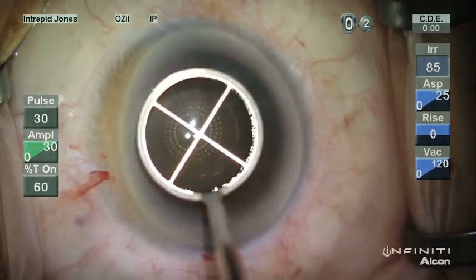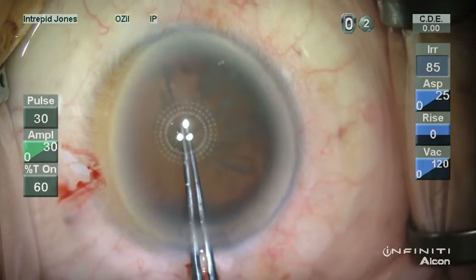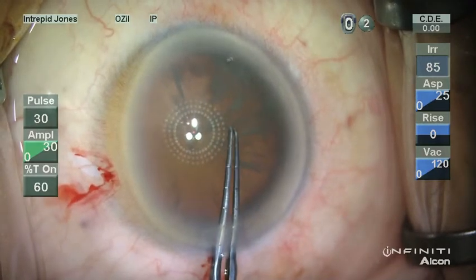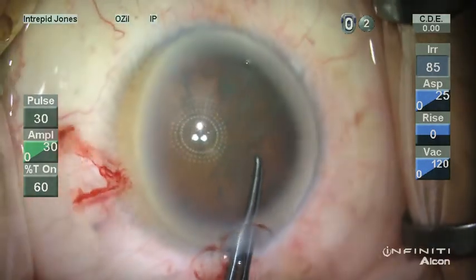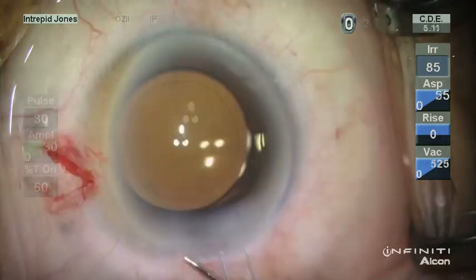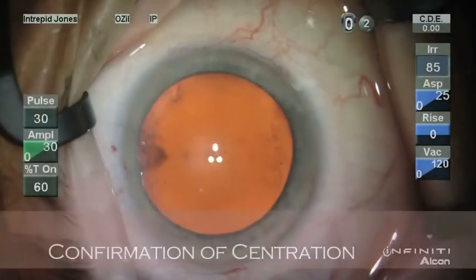Here's a situation which is encountered rather commonly. This patient has an asymmetric limbal architecture. By asking the patient to fixate on the blinking central fixation beacon and inscribe in placing a corneal marker diameter of 5.75 millimeters, I'm able to obtain a very well-centered capsulotomy and a well-centered intraocular lens.